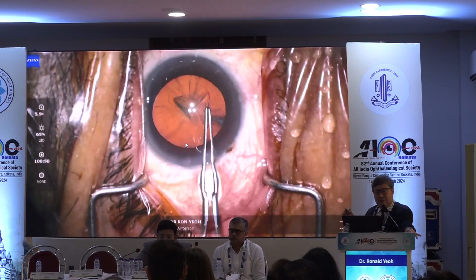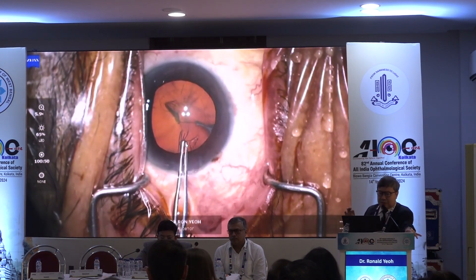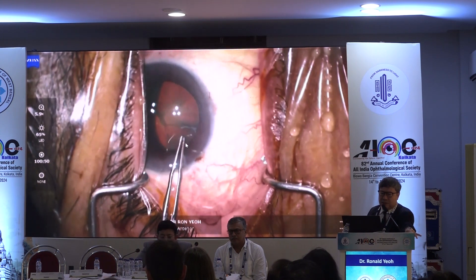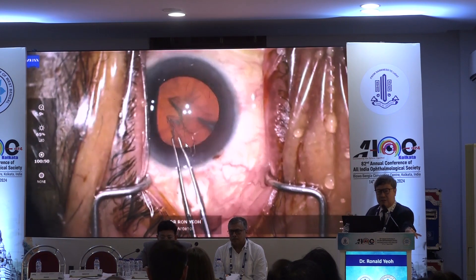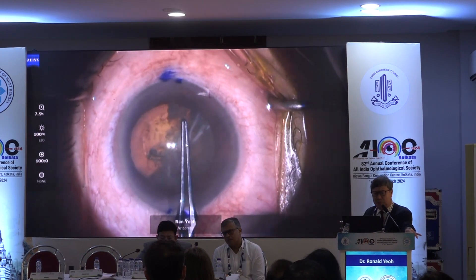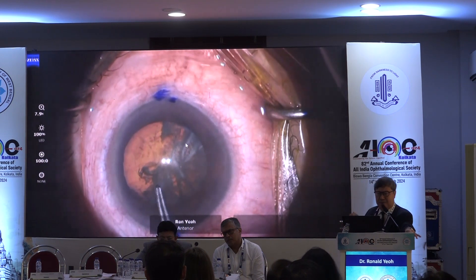Now this is a rather thicker and more opaque band, so it's likely to be more troublesome. When I get there, I will re-grasp it just before I do my next pull and feel it. If I feel a lot of resistance, I will stop, but here I feel that it seems to be okay, so I carry on. And you can see that it tears across the fibrous plaque together with the anterior capsule — that's a nice outcome. It doesn't always happen like this. Now in this case, I've raised the flap — you can see the two fibrous bands there. And as I tear, the capsule actually comes freely over the two fibrous bands without involving them at all. Sometimes you tear over it, sometimes you tear through it.